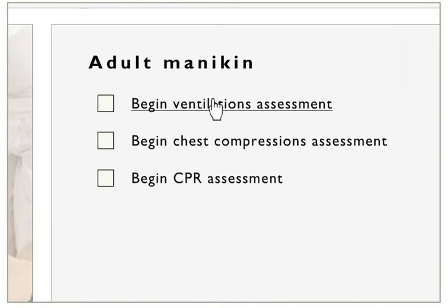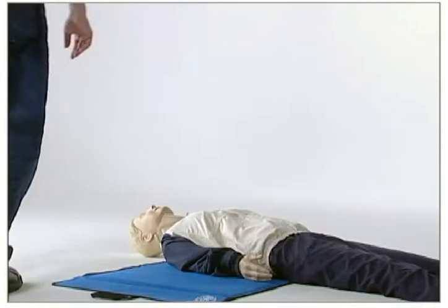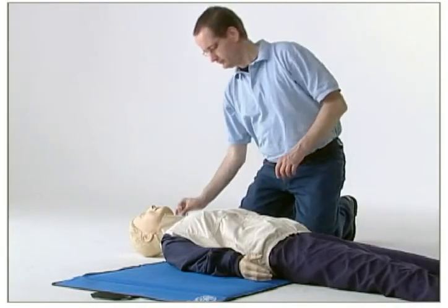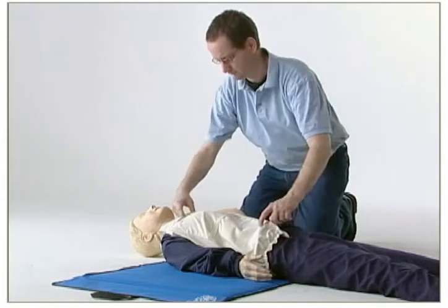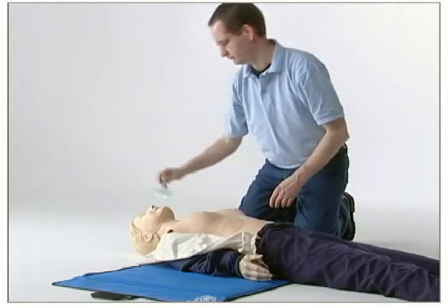Go to the mannequin and follow the instructions. Do 12 ventilations on the mannequin. The computer will instruct you during the exercise. Please pay attention to the instructions, but do not stop performing ventilations.